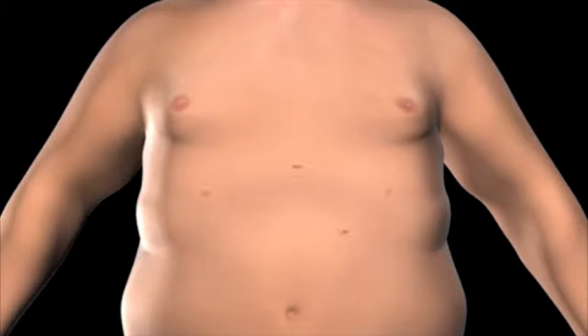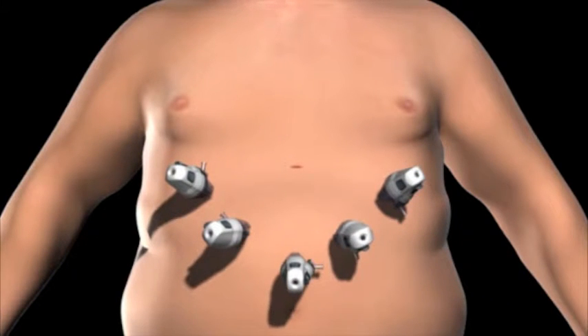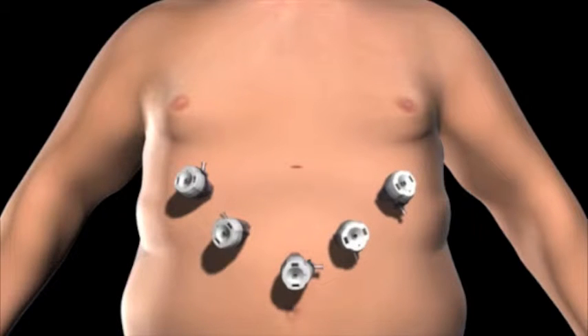Small incisions are created on the abdomen. Trocars, which serve as passageways for the surgical instruments, are placed into the incisions. Surgical instruments are passed through the trocars to access the abdominal cavity.